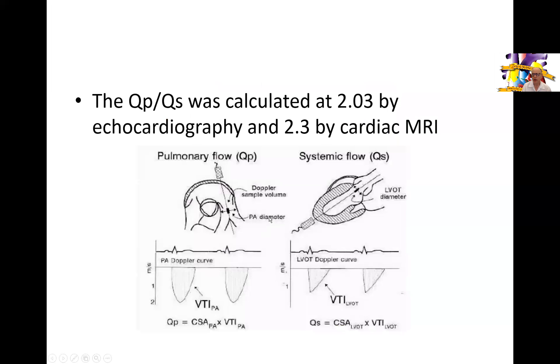We calculated the QP/QS for this patient: by echocardiography it was 2.0, and by MRI it was 2.3 — a very significant shunt. This is a graphic of how this calculation can be done using simple echocardiographic measurements: the flow across the pulmonary valve and the flow across the aortic valve. Those flows should be equal under normal conditions unless you have a shunt.